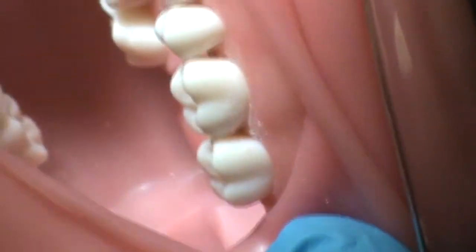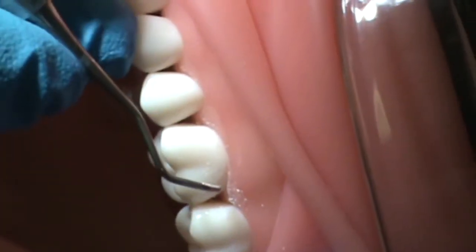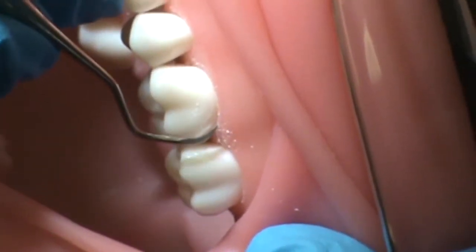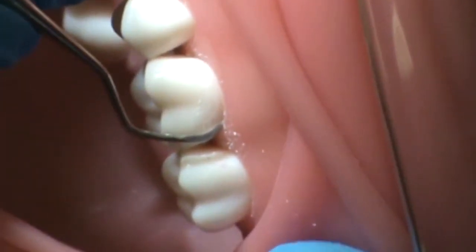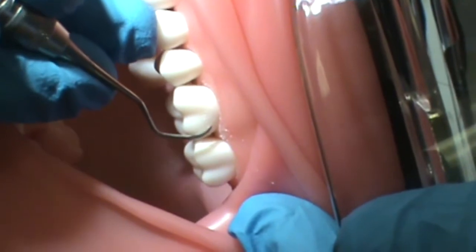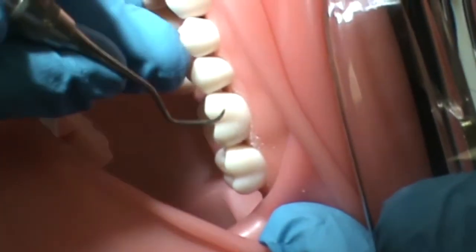Ms. McFell will establish a face-to-tooth surface angulation between 70 to 80 degrees, where the cutting edge is angled slightly towards the tooth and away from tissue to avoid gingival damage. She will be scaling towards the mesial side of the tooth first and will hold her instrument in a modified pen grasp and establish a stable fulcrum.